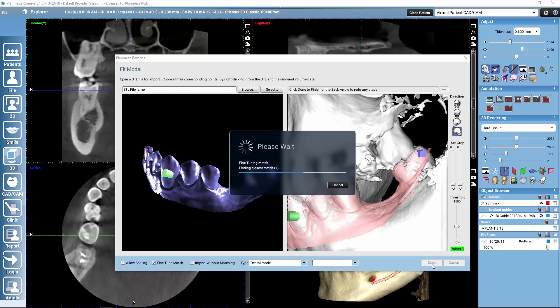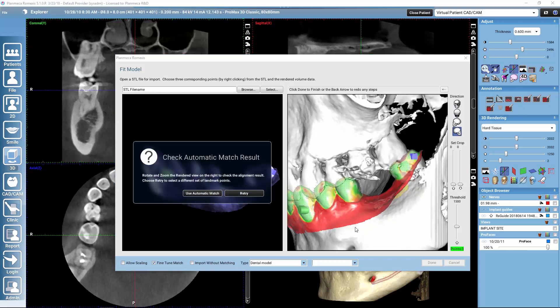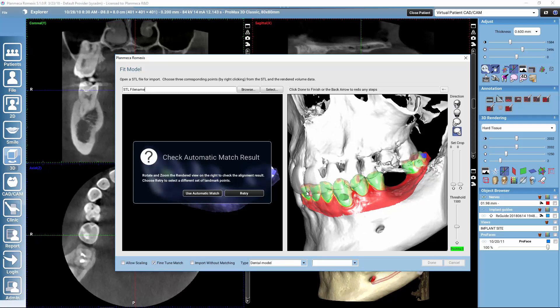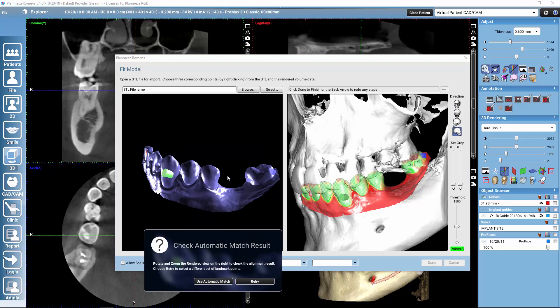Romexis will use a special algorithm to calculate the best match. After calculation it will show a deviation map indicating in color how good the match is: green means very good, red means bad, and yellow means almost good. If the match is very good, the crowns should be green and the gingiva red. The crowns are the part visible on both images — the intraoral scan and the CBCT both show the crowns — but the soft tissue visible on the intraoral scan is not visible on the CBCT, so it appears red because we cannot find a similar surface from both images.